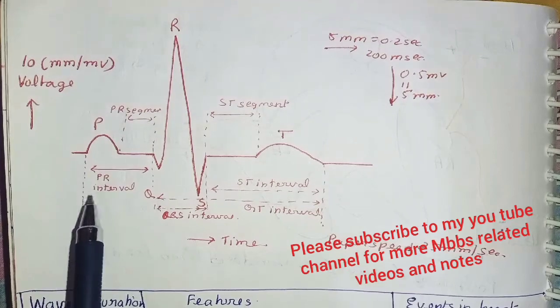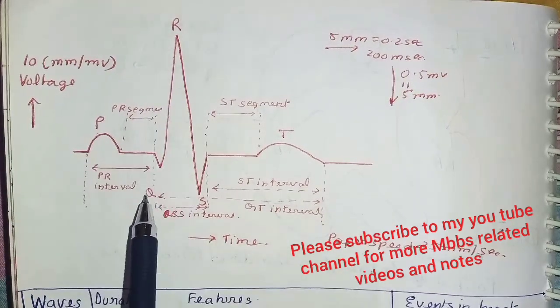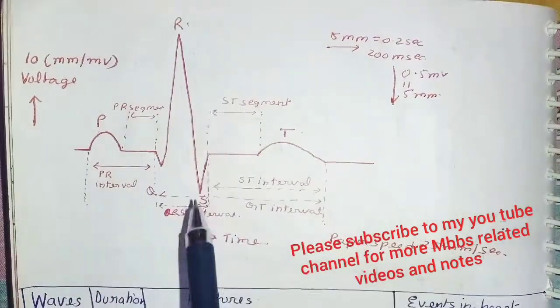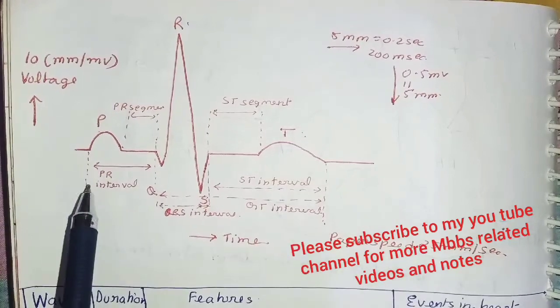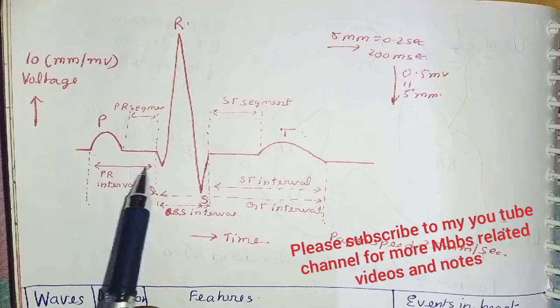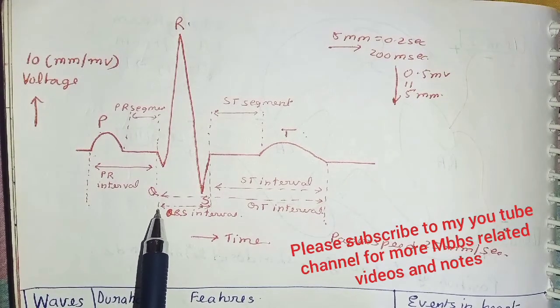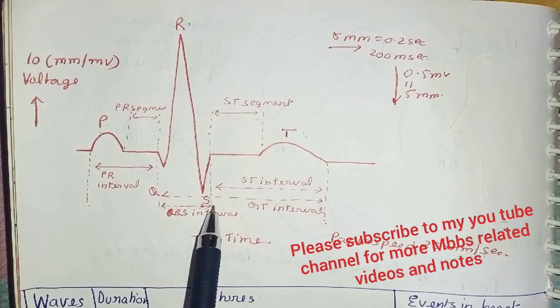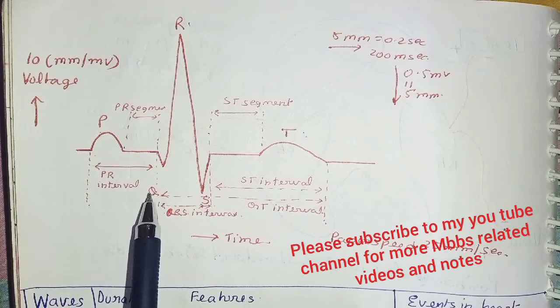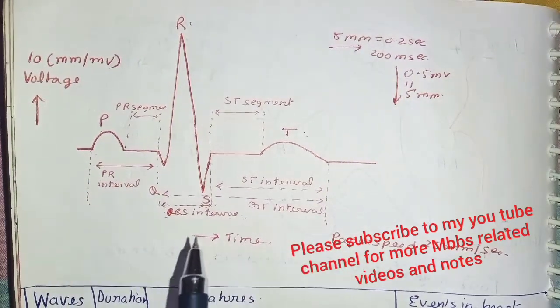As you can see in the diagram, P, Q, R, S and T. This is from P to Q. This is PR interval. From Q to S, it is QRS interval, because it is Q, it is R, it is S. So it is QRS interval.